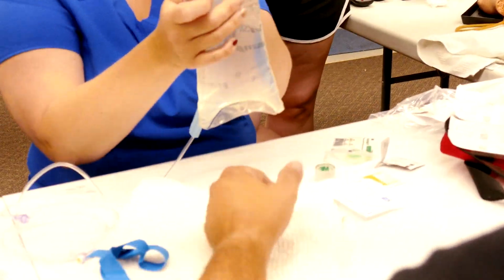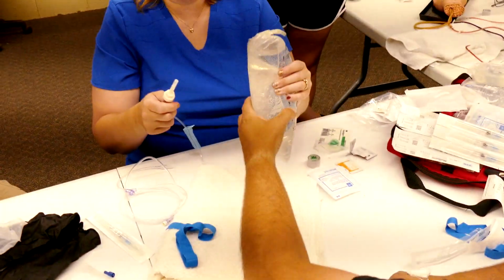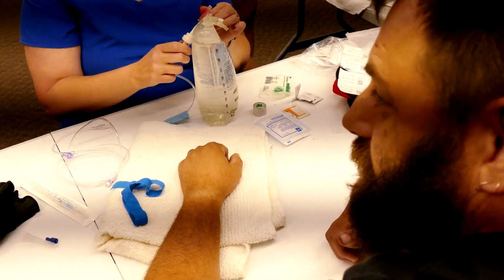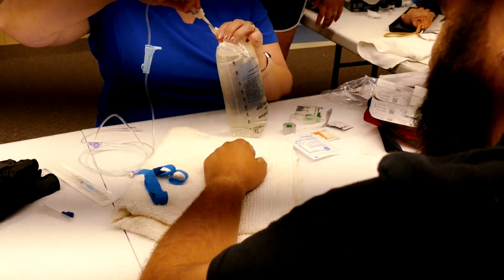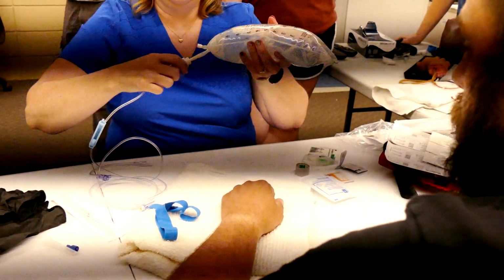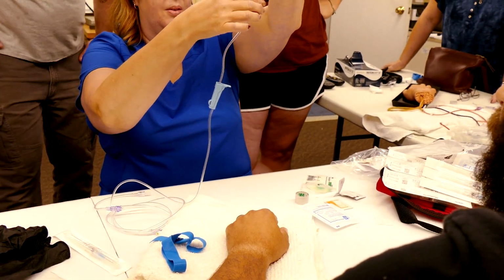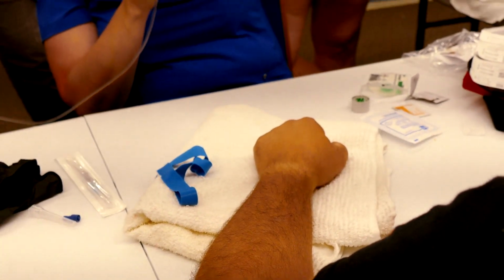But you can still take it upside down and it's not going to go anywhere. Once it's open though, it gets kind of interesting. I've done that more than once too, when I'm going to change bags and it's like, whoosh, the last 200 mils flops out of my leg, but oops. You got it? Push and twist. There you go. Look at that. Boy, we're blowing through your supply budget in one night. I like it. There you go. That's most of your bubbles out. There you go. Comfortable with that.